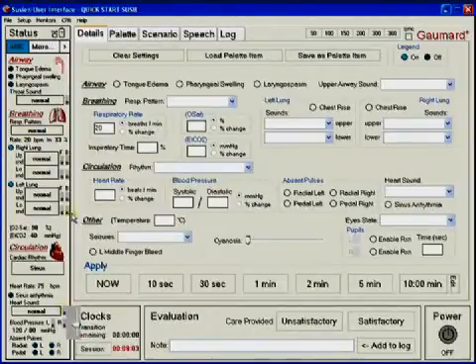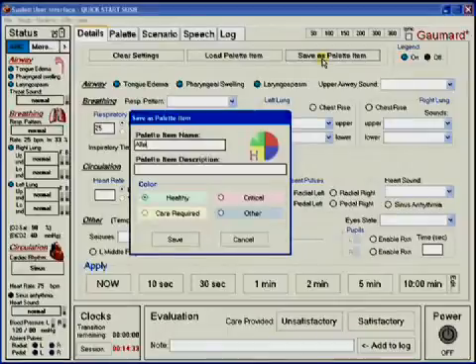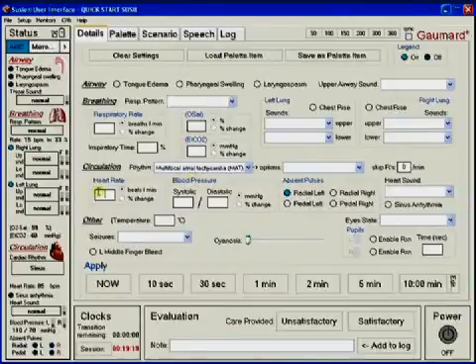From the status viewer, the volume of heart, lung, throat, and Korotkoff sounds can be adjusted. The details tab is the first one presented to the user after starting up the software. From this area, users can change the parameters associated with SUSI's physiologic state. Parameters are selected using the drop-down menus, three-state switches, and integer boxes on the details page.